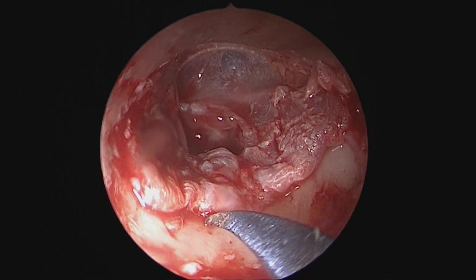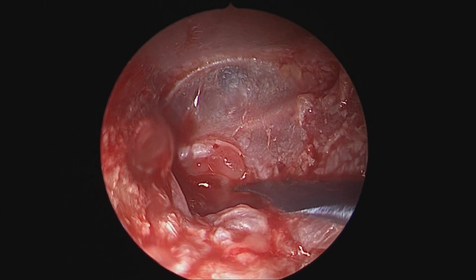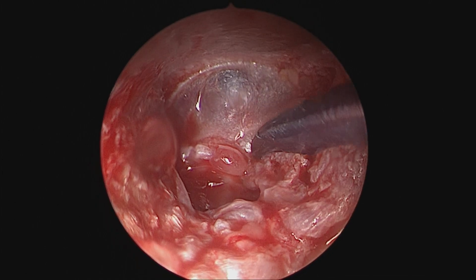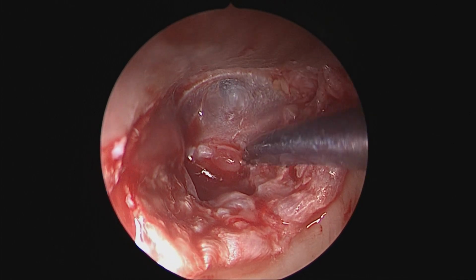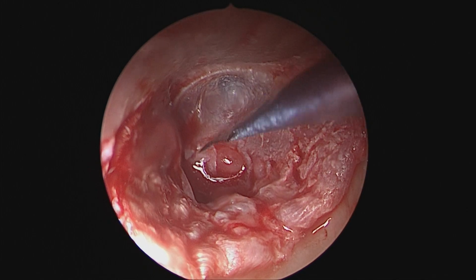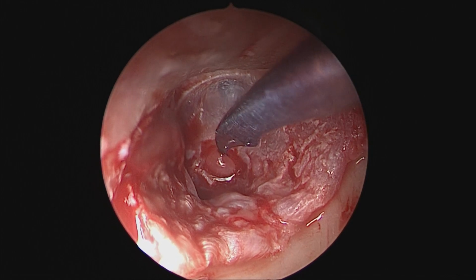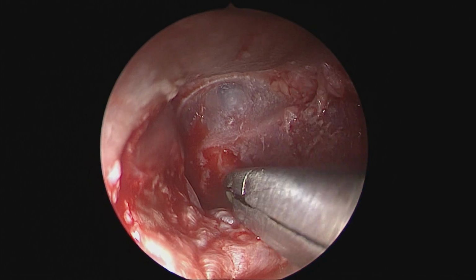Now, as we put our tympanomeatal flap back, we can see that this is the perforation that we are working with. Anteriorly, you can still see some diseased edematous middle ear mucosa, though no epithelium. So we would just freshen the margins anteriorly, generously, and also clear this excess and diseased mucosa, which was already harboring bacterial infection.